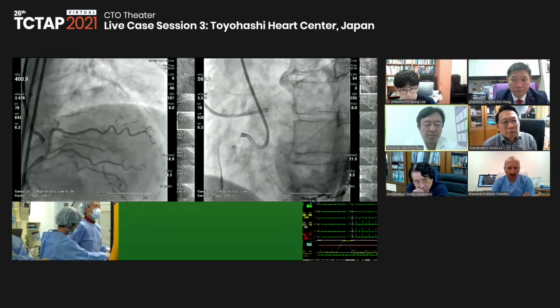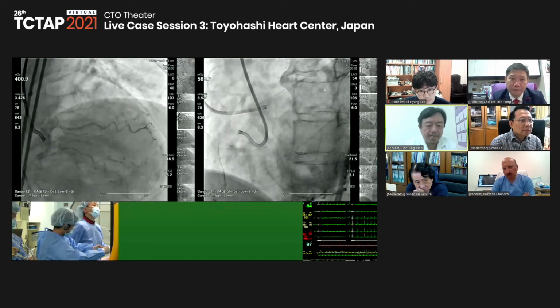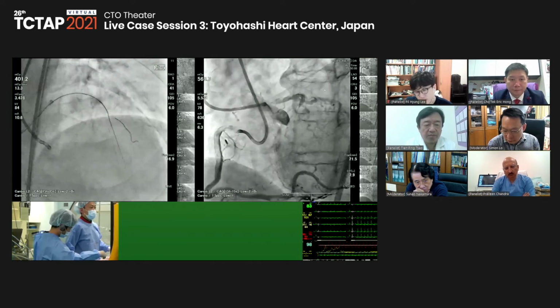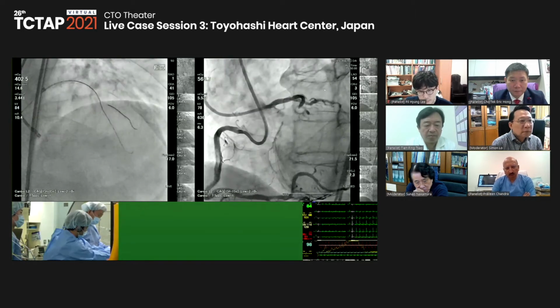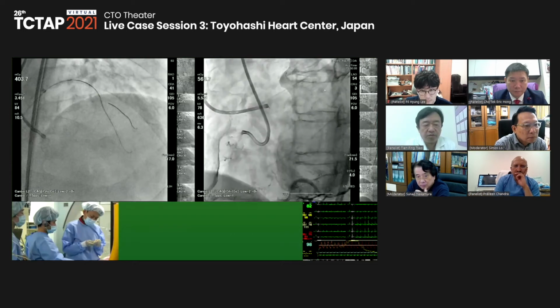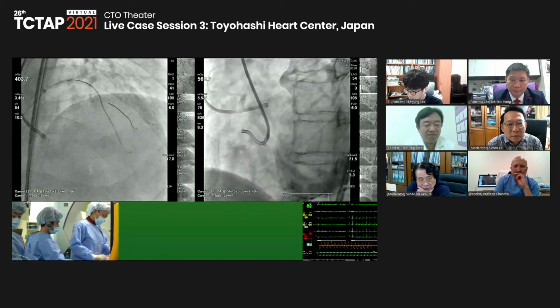Yes. And also the proximal side of the LAD lumen is very big, right? So going from the big space to selecting the small space is usually very difficult. Yes. In addition, this case has a very tricky angle at the beginning of the channel. So maybe the microcatheter didn't work well, I guess. A microcatheter cannot provide steady support in this kind of region. Yes. So the DLC is better for stabilization.